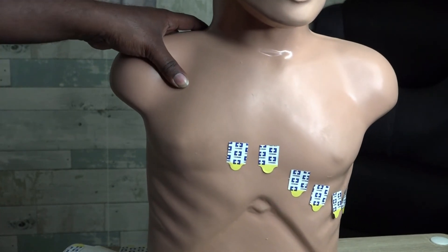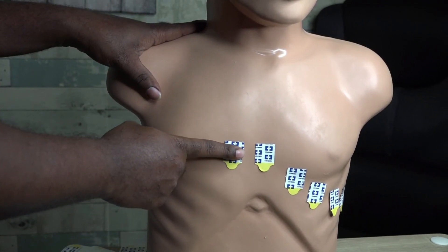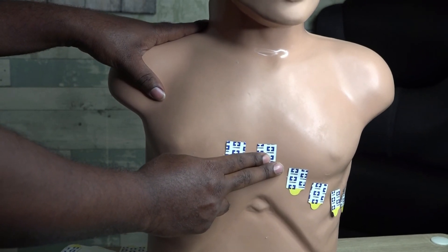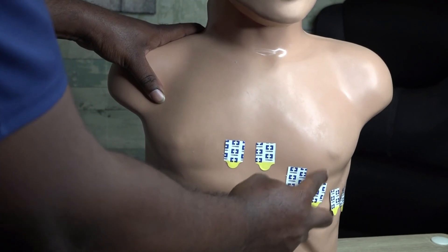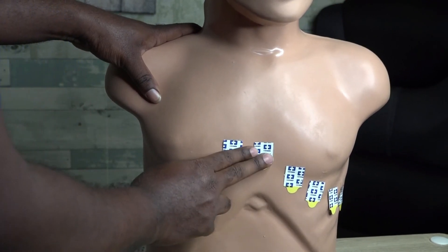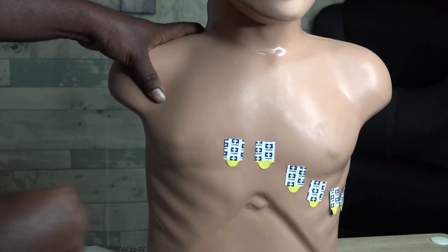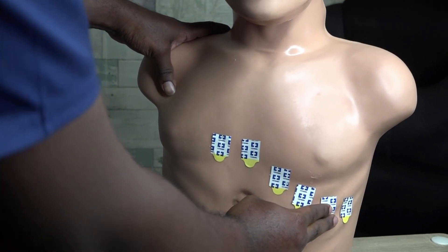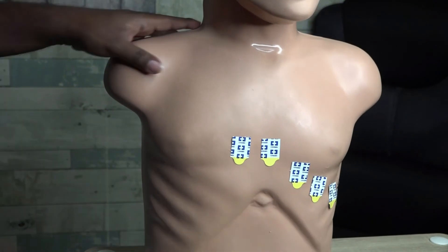That completes our EKG lead placement. To summarize: V1 is at the fourth intercostal space, right margin of the sternum; V2 is at the fourth intercostal space along the left margin of the sternum; V4 is at the fifth intercostal space, mid-clavicular line, right below the nipple; V3 is midway between V2 and V4; V5 is at the fifth intercostal space at the anterior axillary line; and V6 is at the fifth intercostal space at the mid-axillary line.